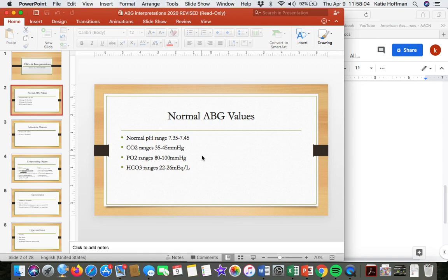It is a calculated value on our machines. I, as a therapist, will look at it to help determine if our blood gas has a metabolic factor in it or not. Any negative base excess will give you a metabolic acidosis, and the extent is determined by how negative your base excess is. Like Katie was saying, if you're hypovolemic and traumatic and lost a lot of volume, that base excess will be -15 or -20. The more negative it gets, the more acidotic you get.